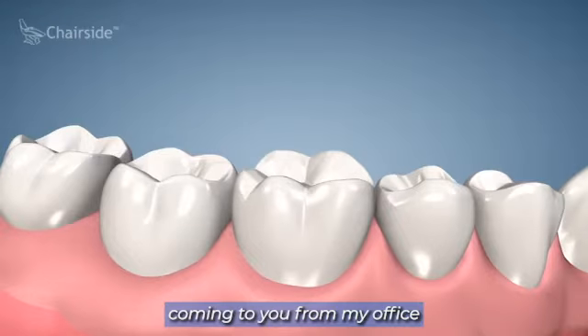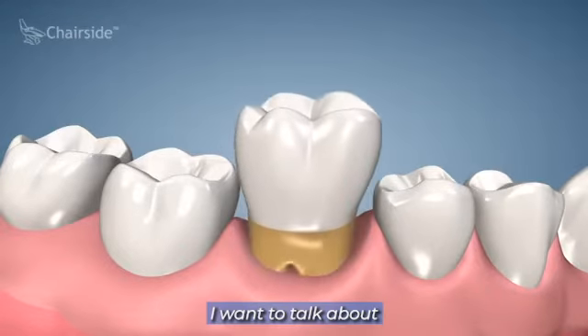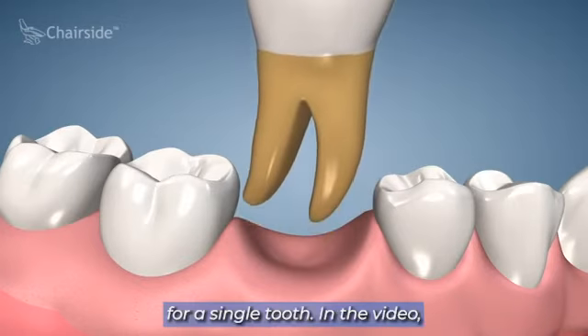This is Dr. Jason Dulac coming to you from my office in Springfield, Virginia. Today I wanted to talk about implant replacement for a single tooth.